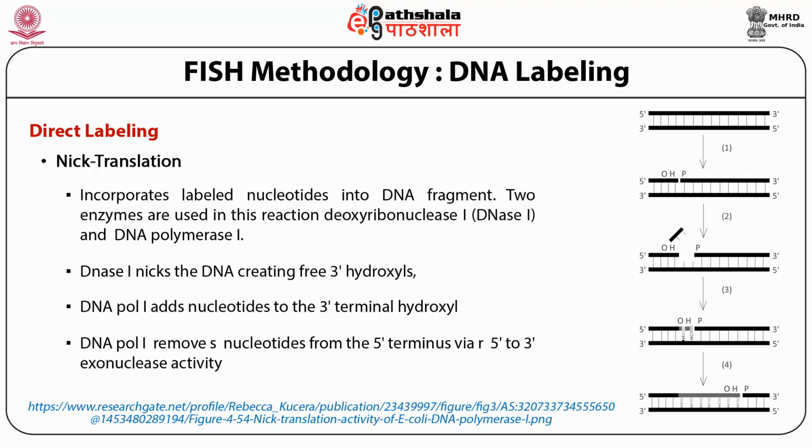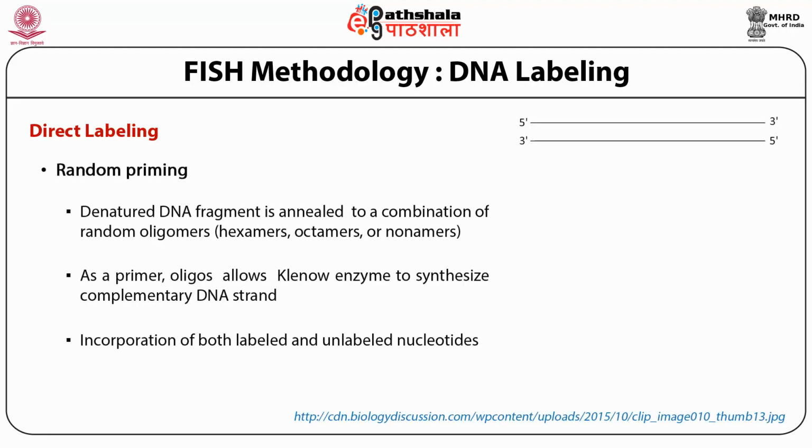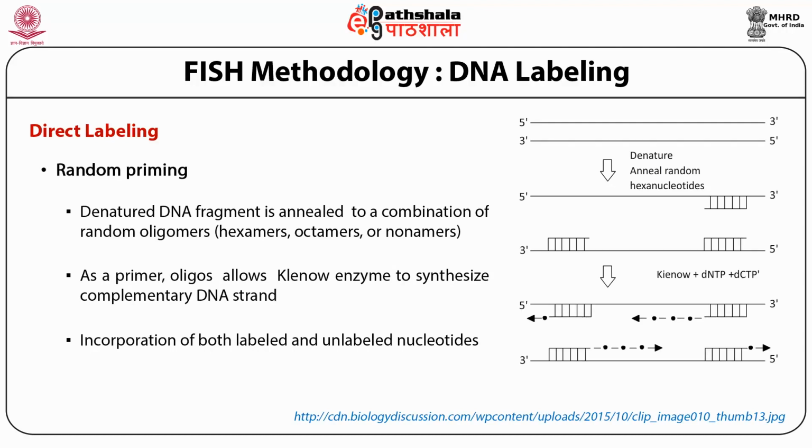There is only one dNTP, either dUTP, which is labeled with a fluorophore, that is tagged. Therefore, the distribution of the fluorophore-tagged dNTP is not overwhelming. It's 1 or 2 bases in every 100 nucleotides.